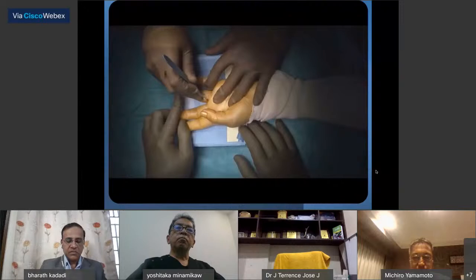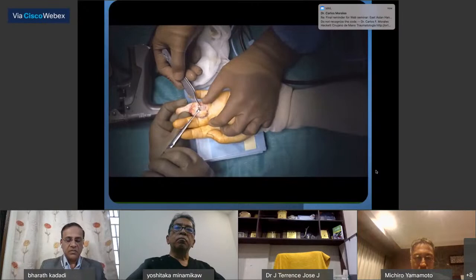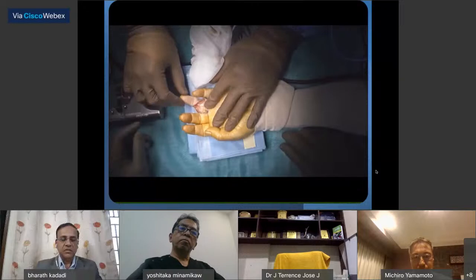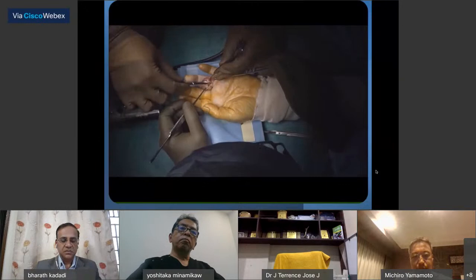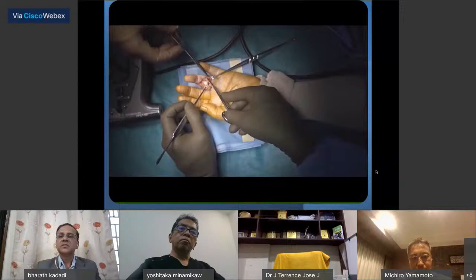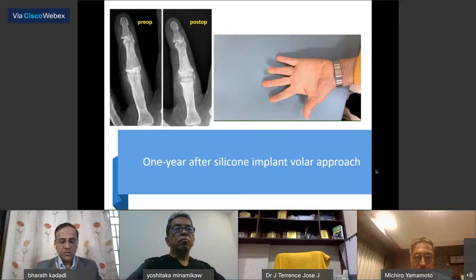Surgery was performed under axillary block. The A3 pulley is incised with a volar approach to expose the PIP joint. The proximal phalanx head was resected and a silicone implant was inserted. The volar plate was repaired and the skin closed. One year after the surgery, there was no pain and the range of motion of the PIP joint improved to 80 degrees flexion and minus 10 degrees extension.